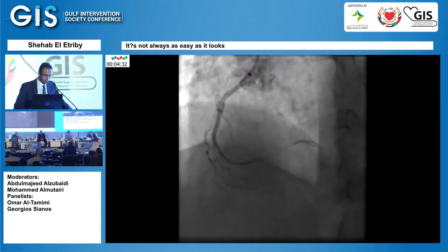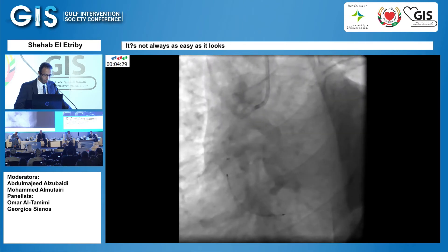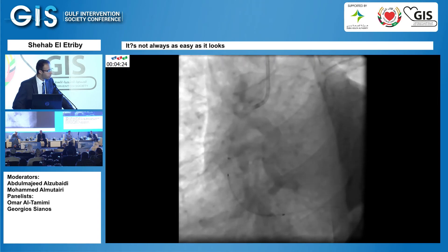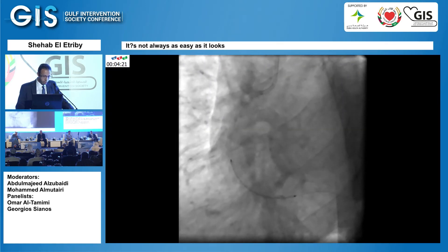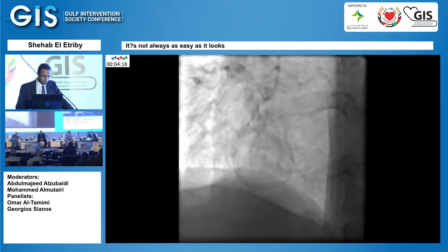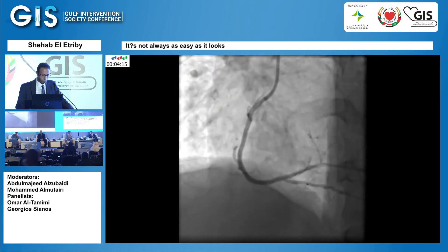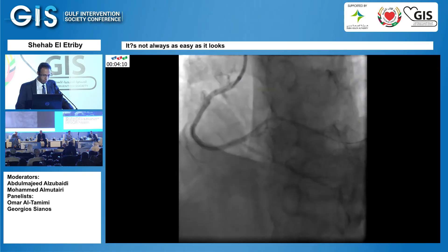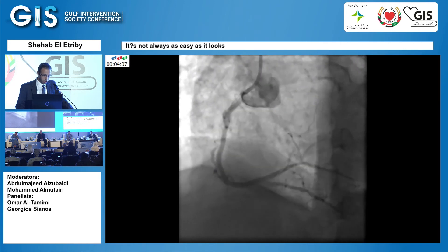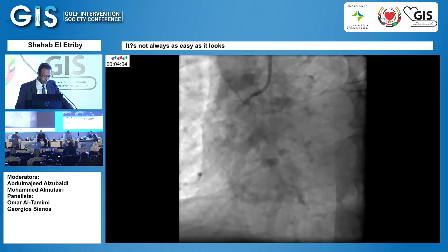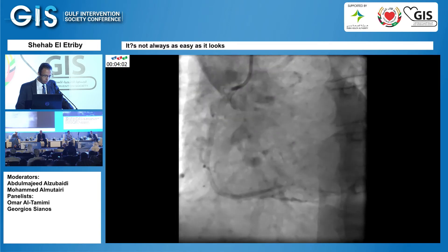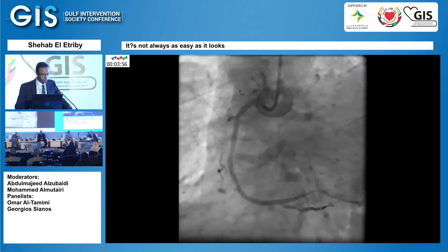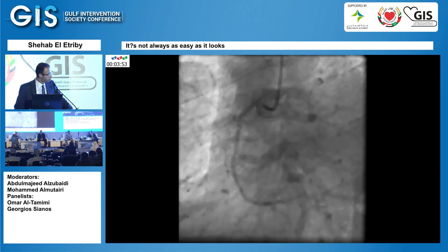After the first stent, flow regained a bit. To enter with the second stent, I used the guide liner to the distal part of the first stent, and passed another 3.5 by 48 stent in the RCA. This was the final result of the RCA. I did an injection from outside to confirm there was no dissection and that the stent was at the ostium. Everything passed smoothly.